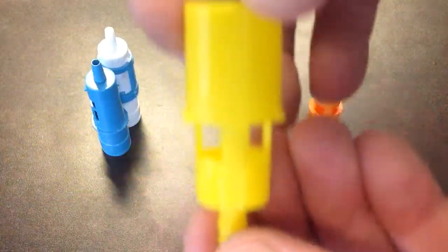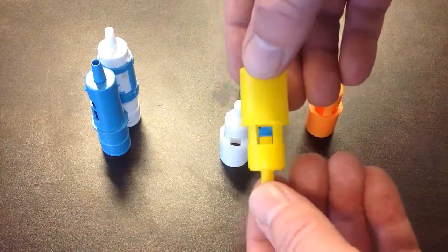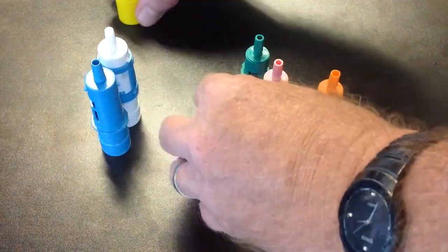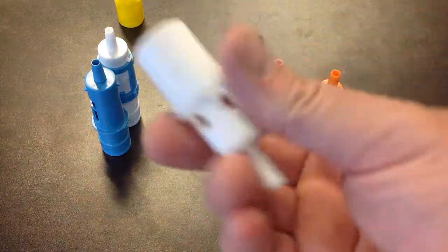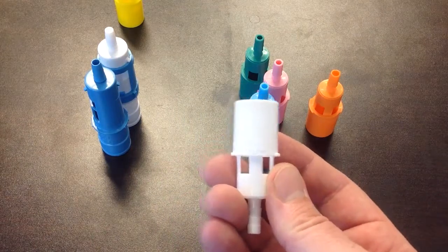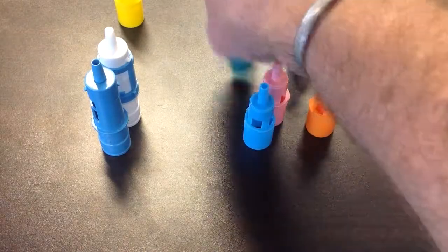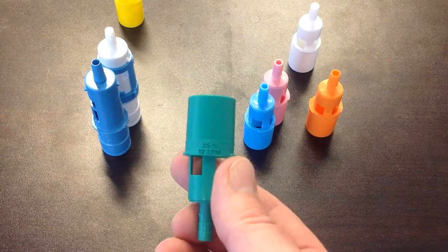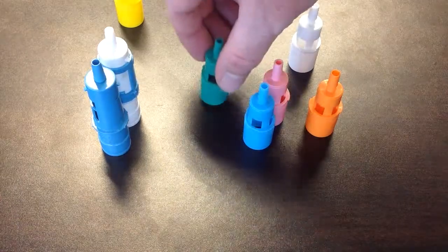This one is hard to read. It actually says 28% at 6 liters per minute. This one is 31% at 8 liters per minute. You do not have to memorize these. Here's an easy to read one. 35% at 12 liters per minute. Each color is a different level of oxygen.